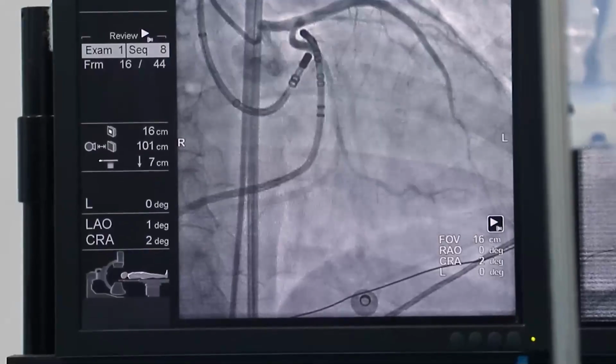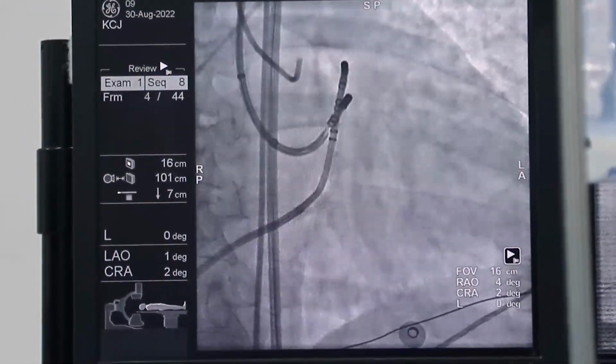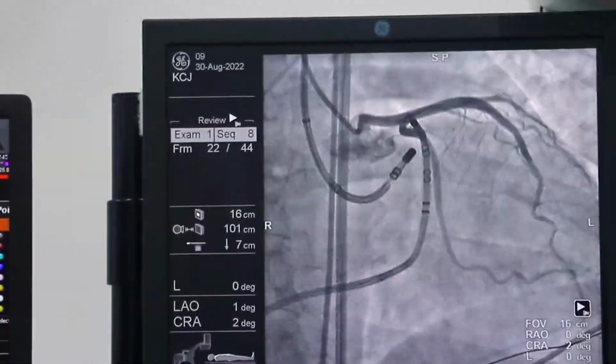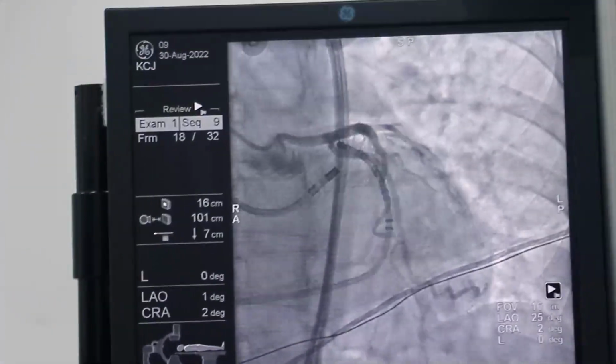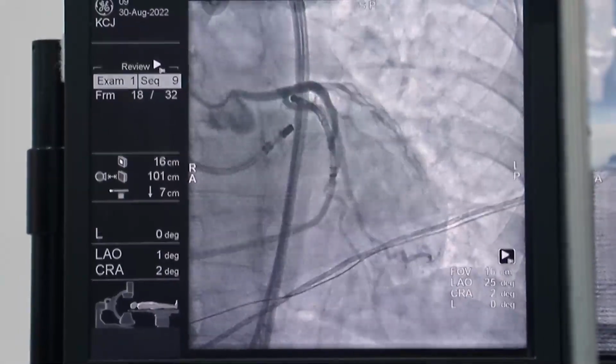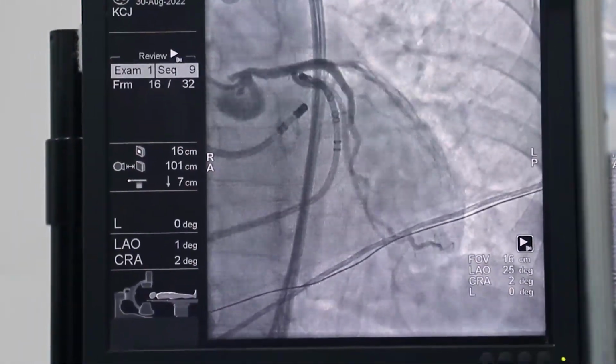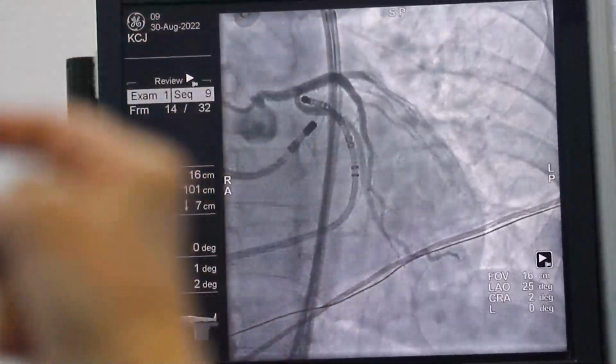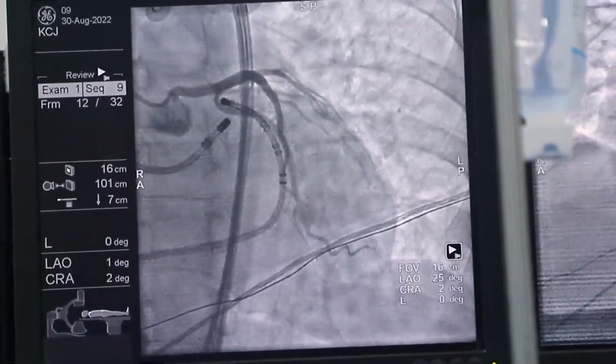Isn't that the small circ? Yes. We are very close, but alhamdulillah, no spasm, no obstruction, nothing. As you can see that the CS catheter is going into the summit. Yeah, very nice signal. Now we'll go to the carto.